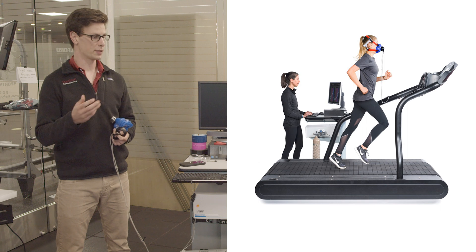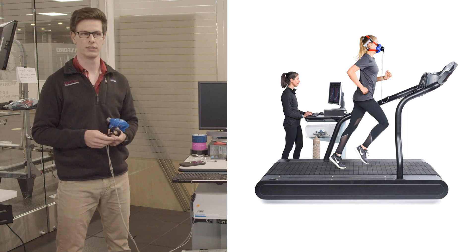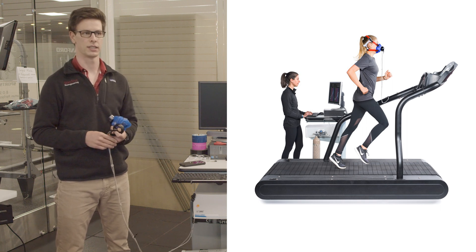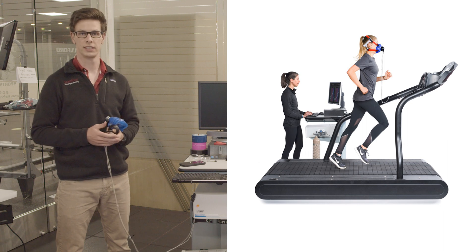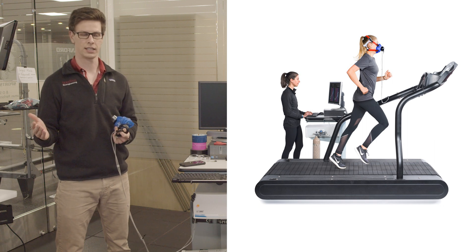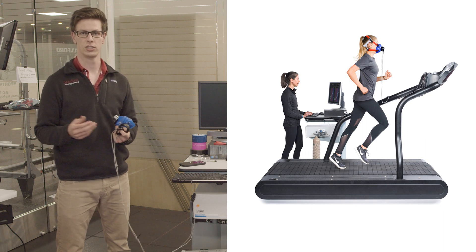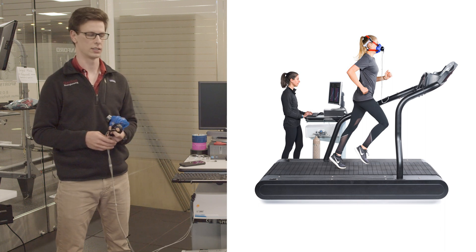Typically for an experiment like this, we'd have somebody do an activity until they reach steady state — something like two minutes of doing the exact same thing — and we could then find their steady-state energy consumption, expressed as something like watts per kilogram.